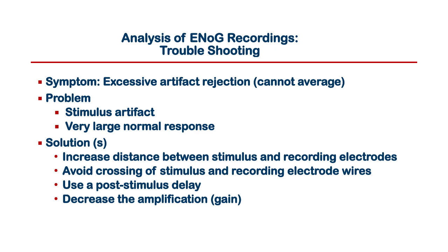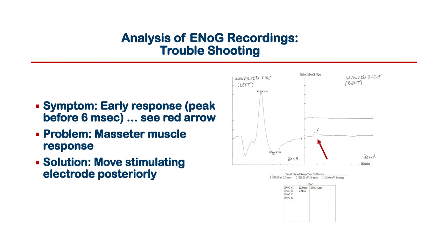And sometimes you just need to eliminate the artifact reject so that you can actually see a response.